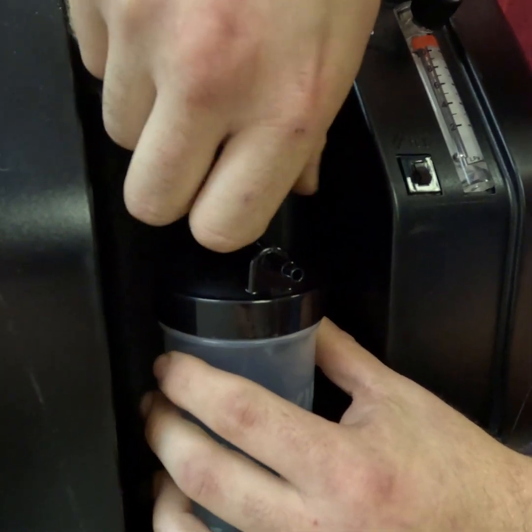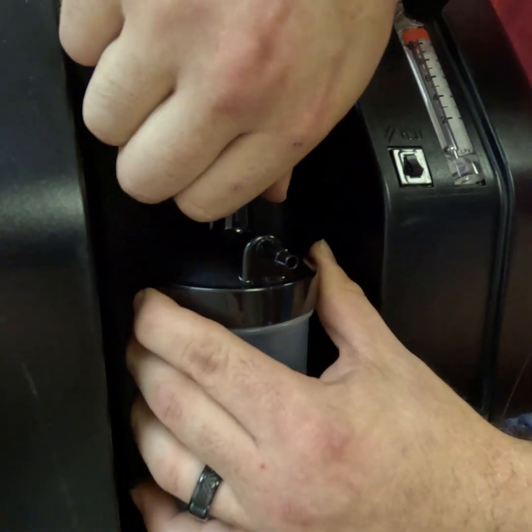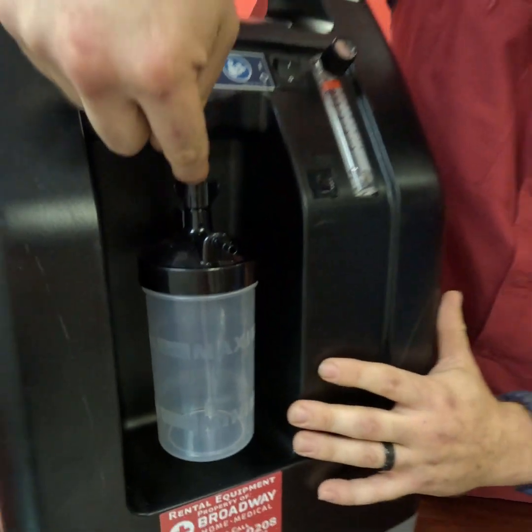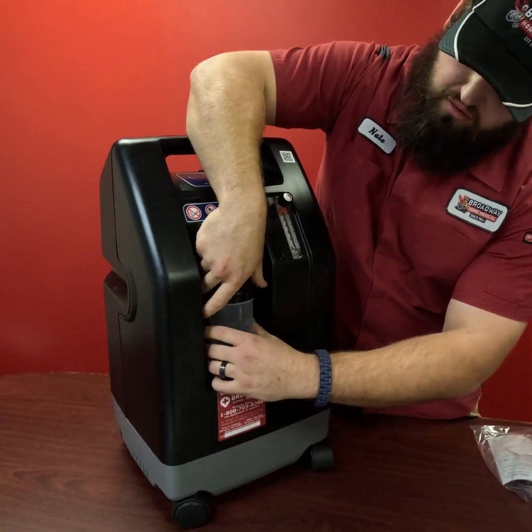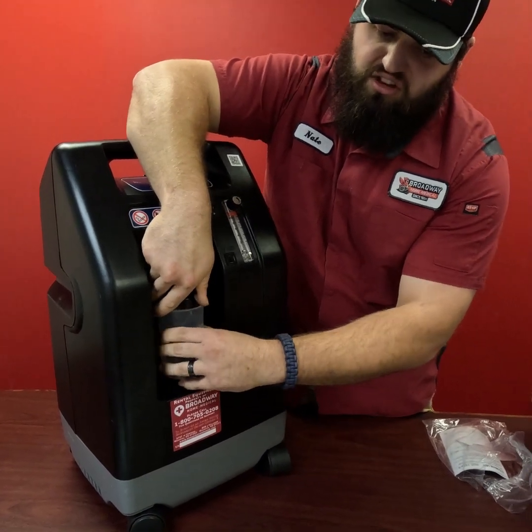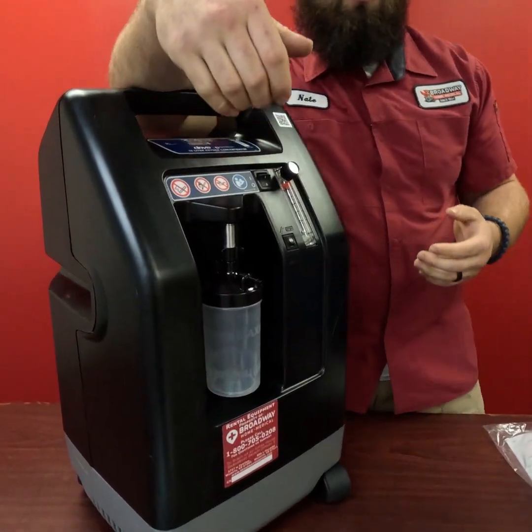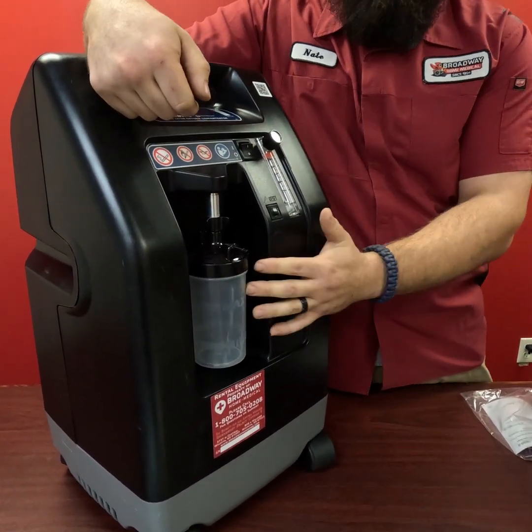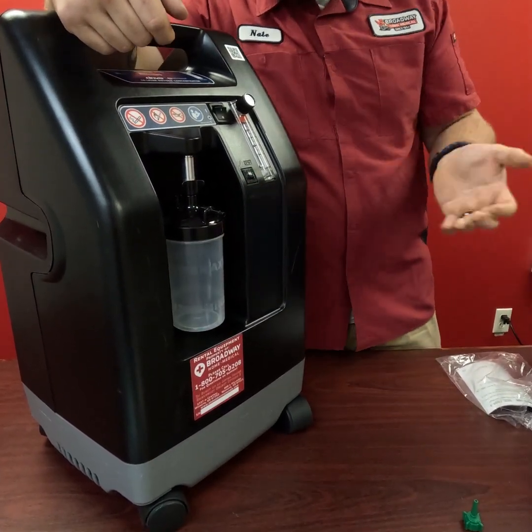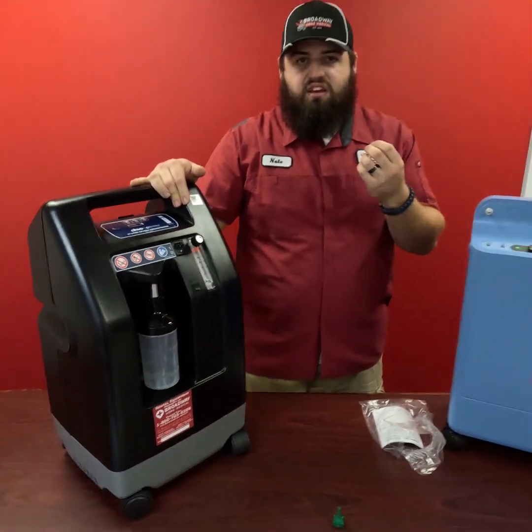Now I do recommend that whenever we're doing this, we be very, very careful, because these humidifier jars are very easy to cross thread. They're easy to cross thread right here, and they're also easy to cross thread from jar to lid as well. So you always want to make sure that you're getting a good connection there. We have a lot of situations where these humidifier jars cause problems for people just because they can't get that on correctly, and a lot of people will experience issues where they're not feeling like they're getting enough oxygen.